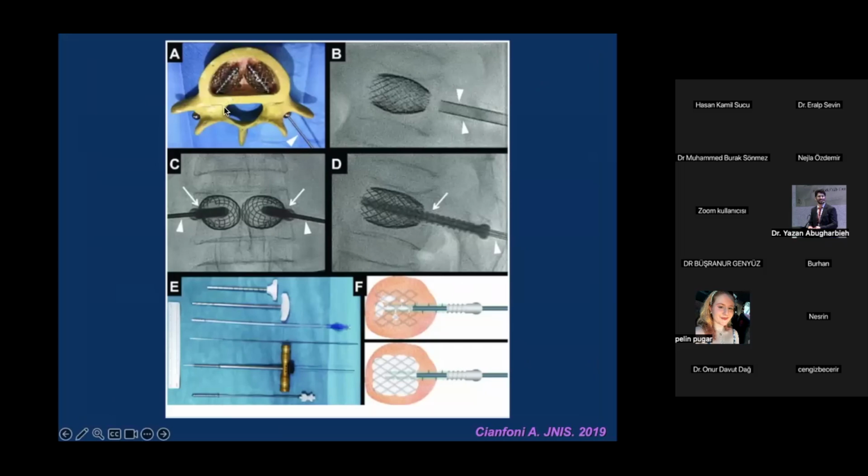First you put some cannula in the pedicle. Through this cannula, you will deploy a stent mounted on a balloon. And afterward, through the pedicle, you will put some screw, one screw in each pedicle. And finally, you will inject some cement to finalize this setup.